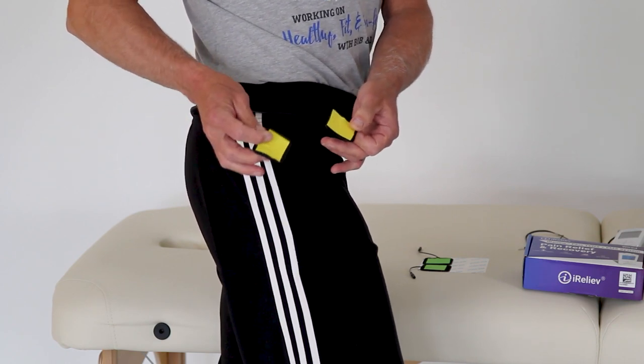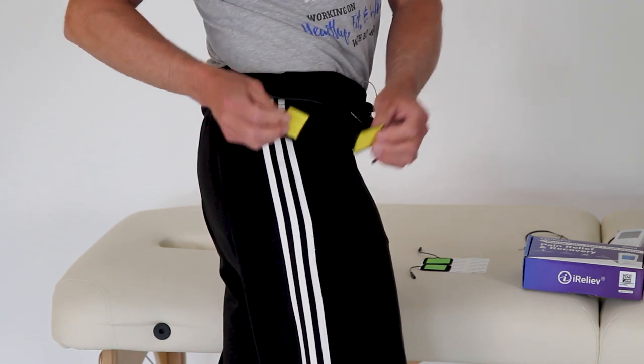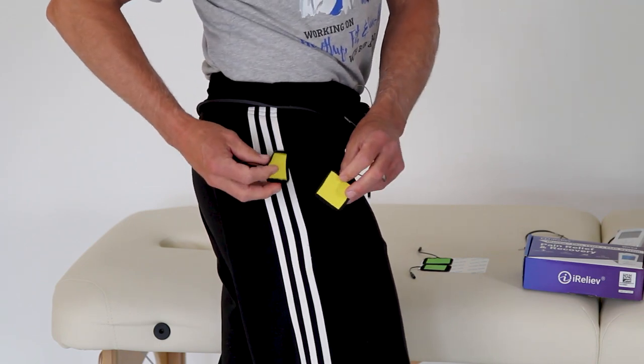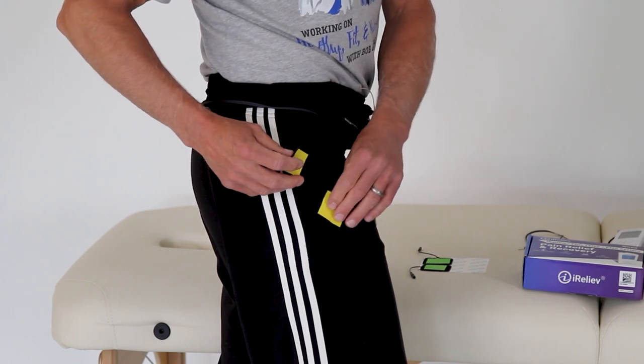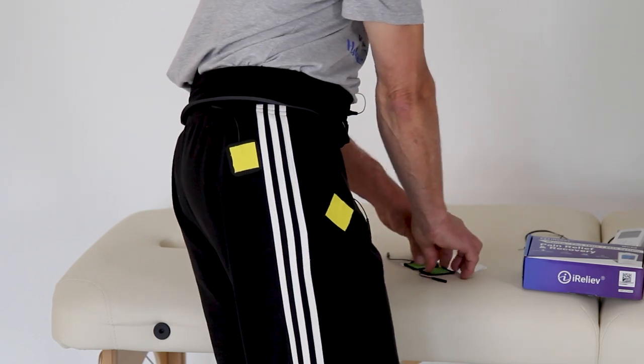The yellow on your electrodes, they're not going to be color-coded. They'll be black. Sometimes they're white, but they don't have yellow and green like we have. We did that for educational instruction purposes. So yellow in our case is channel one, and the green is channel two.